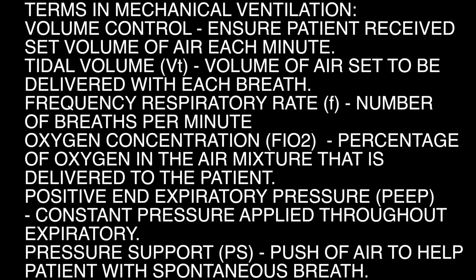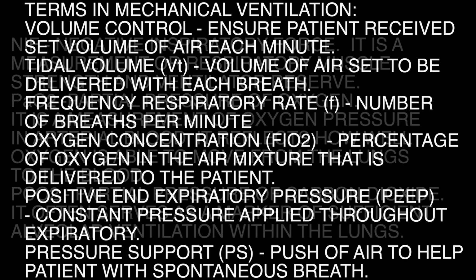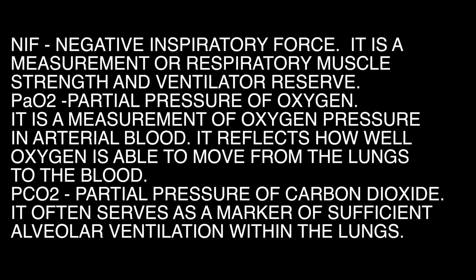Pressure support, PS, is a push of air to help the patient with a spontaneous breath. NIF, negative inspiratory force, is a measurement of respiratory muscle strength and ventilator reserve.